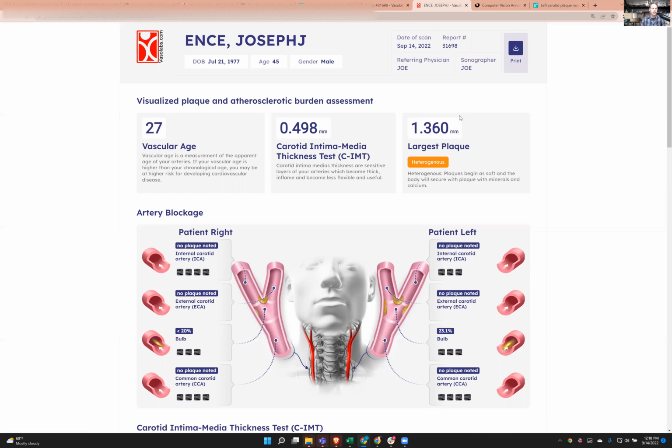Heart disease kills half of America. This tool should help us see it, identify it, and with good medication and therapy, you should be able to avoid a heart attack altogether.